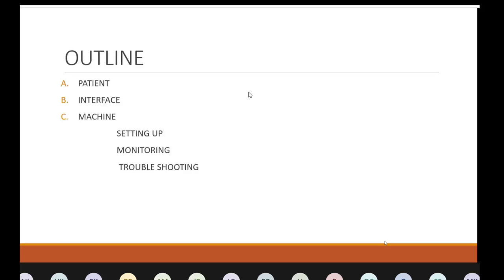We are going to give in air. Ask the patient to try to synchronize his breath with the breath that the ventilator is giving. Allow the ventilator to breathe for you. Tell them this will give them confidence. Tell them that we can stop when he is uncomfortable. Choose the right size of mask. Decide on what FiO2 you want to give. We talked about the difference between the low FiO2 that can be delivered by a BiPAP machine and the high FiO2 delivered by a critical care ventilator.